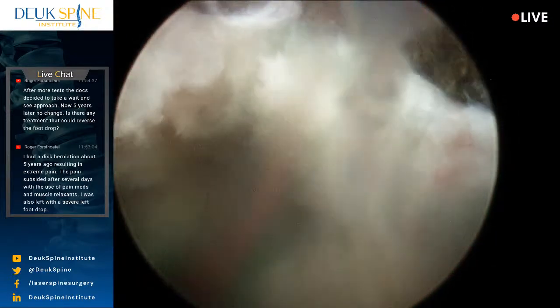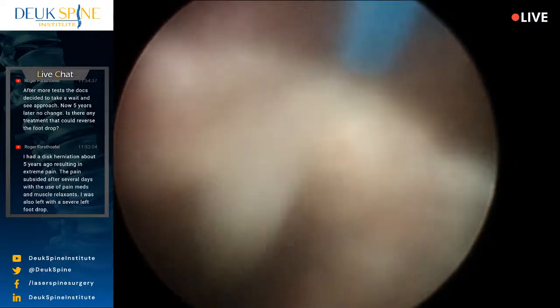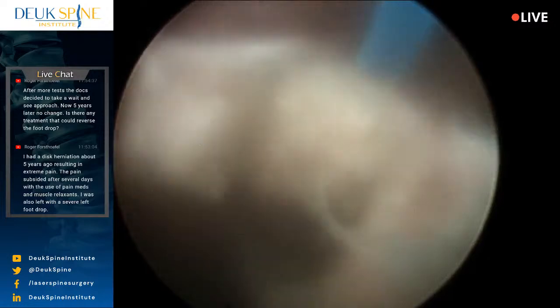Don't move that. This is lateral in the foramen here.